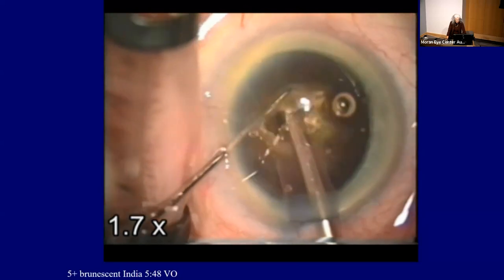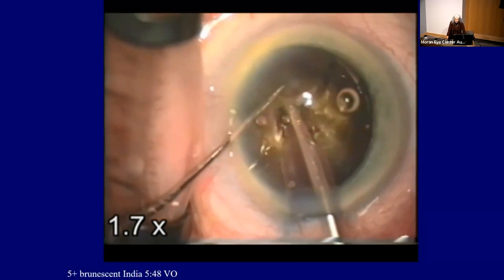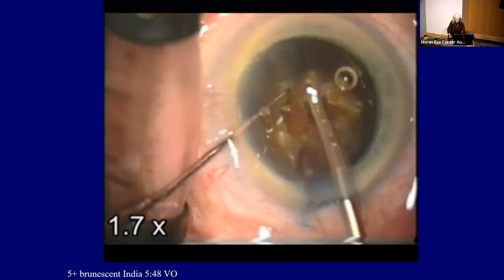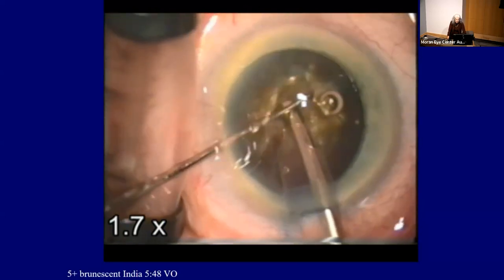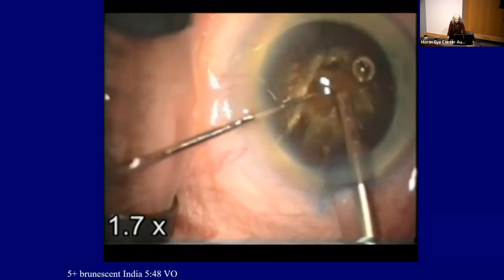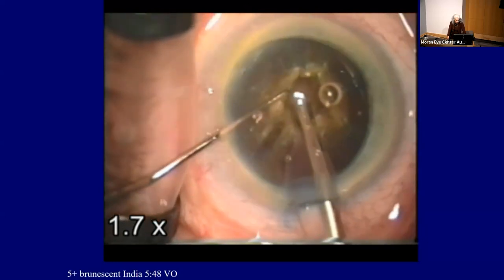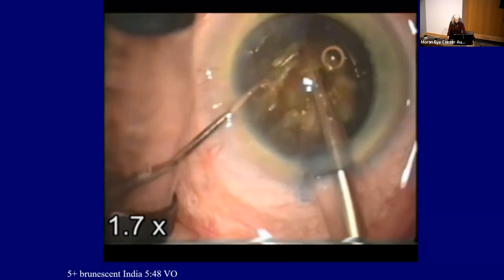And what I'm doing is not trying at all to make a chop through the posterior plate. What I'm trying to do is open the lens kind of like a clamshell in order to get the meat inside. There's always an endonuclear plane, even though we can't hydrodelineate it like we would in a soft lens. That plane exists. And so what I'm doing is I'm opening the lens.